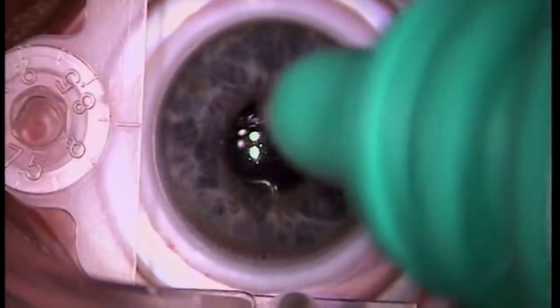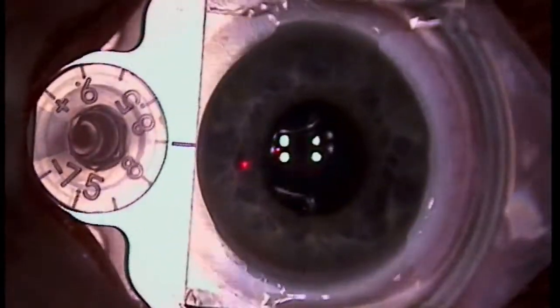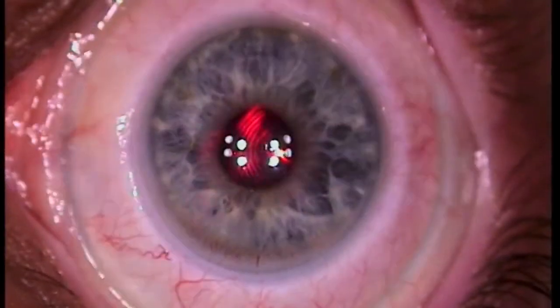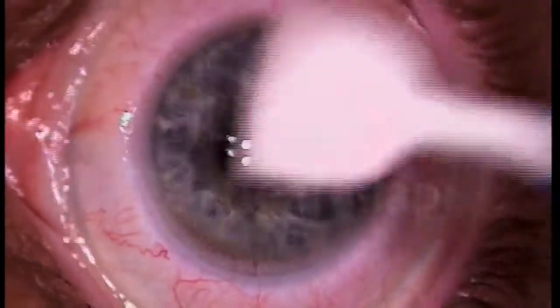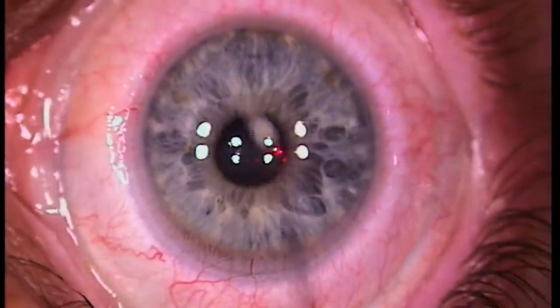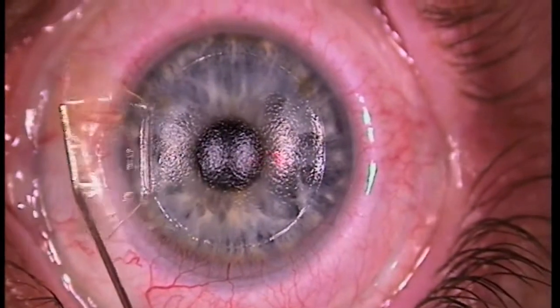And when I push, everything tends to get a little dim and dark. Notice it's getting a little dark. And then you're going to notice that the green light — it's going to come back on again. Just a second. And you're going to be able to find it. There it is. I'm going to go ahead and make it all get pretty fuzzy. That's what's up.